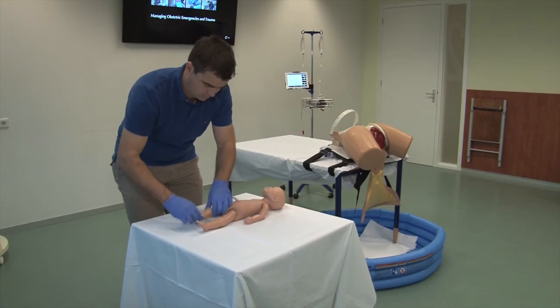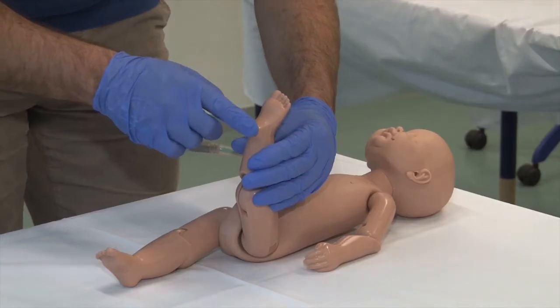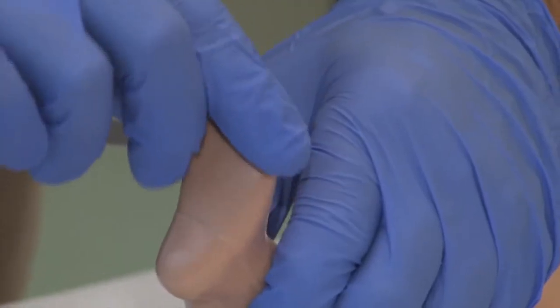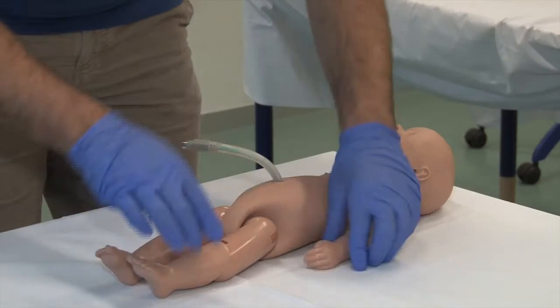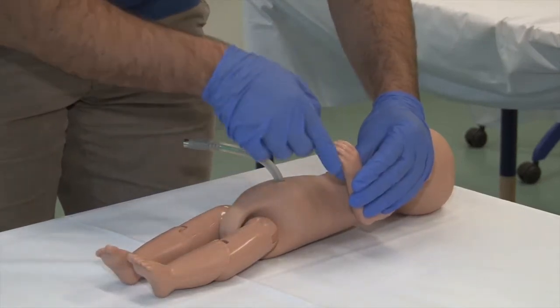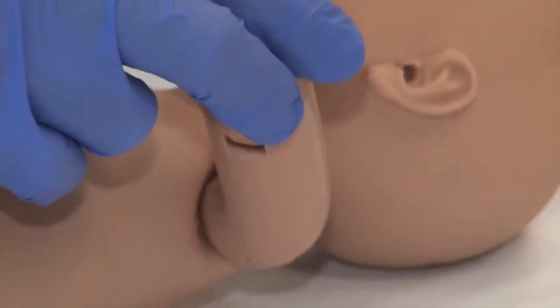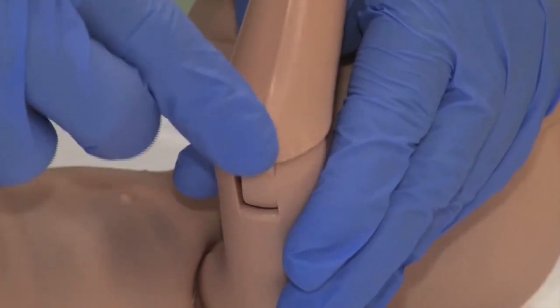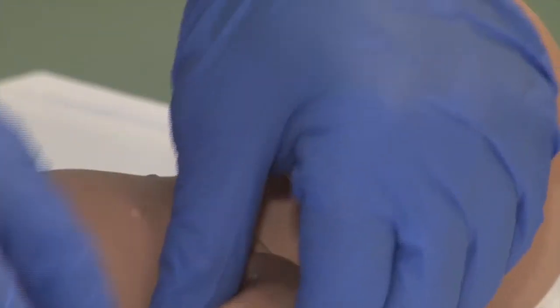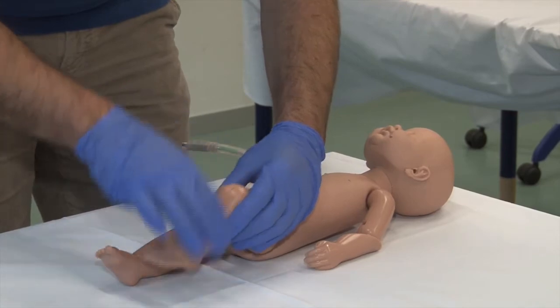Prior to the exercise, the landmarks for recognition of fetal feet from hands can be pointed out to the candidate: a foot has a firm heel with toes lying on a straight line. A hand does not have a heel and can be grasped as for greeting, and fingertips are not in a straight line. Palpation of the elbow indicates a pointy protuberance formed by the olecranon, which is not the case at the knee where a small dip is felt.